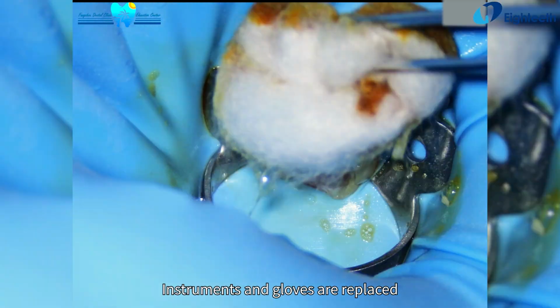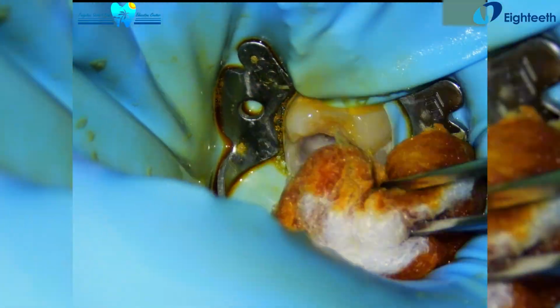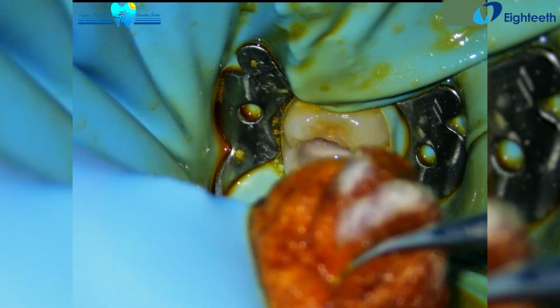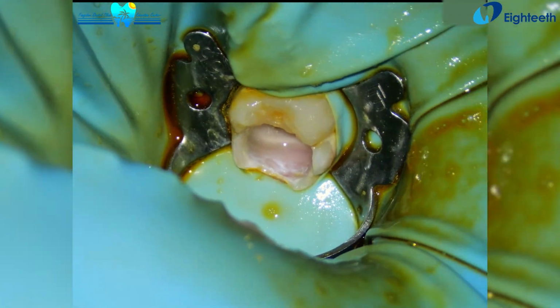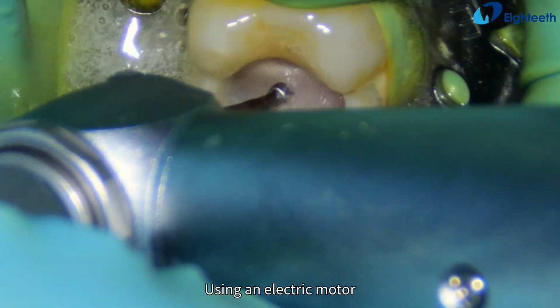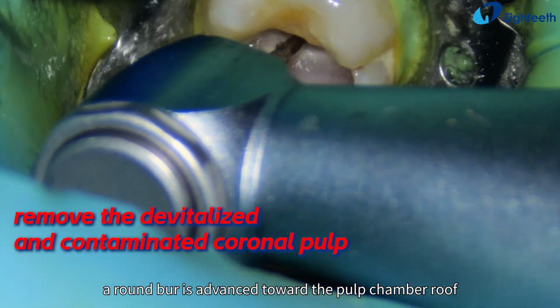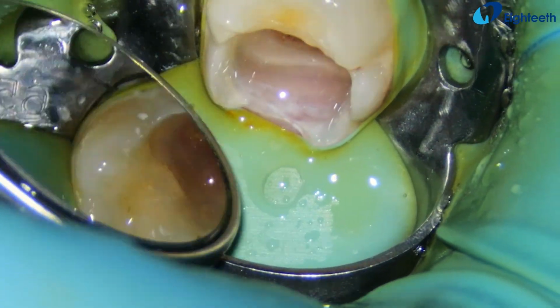Instruments and gloves are replaced. Using an electric motor with sterile ice-cold saline at 3000 revolutions per minute, a round burr is advanced toward the pulp chamber roof to remove the devitalized and contaminated coronal pulp.